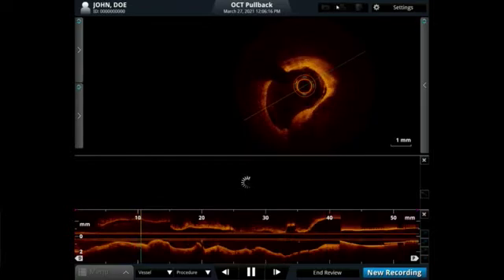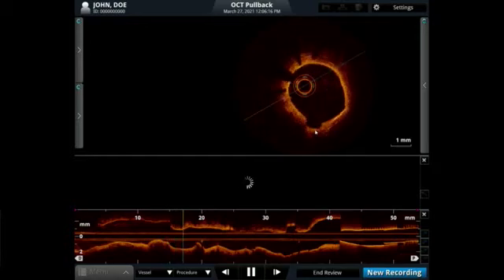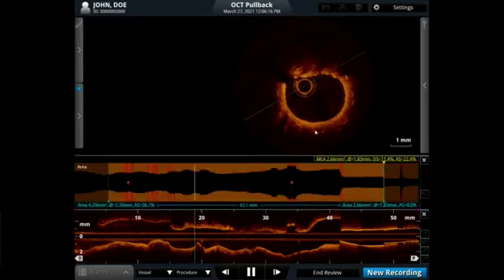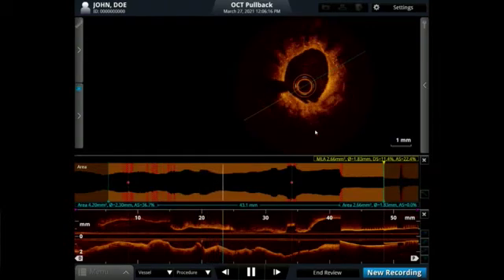You know, slow down. Wow, this is the spot. Look at that. So I see the crack there. Yep, you saw that. Yeah, I'll bring it back there. So you had it in the same position, right? Yes, sir. Oh my goodness! So look at the difference in the MLA.